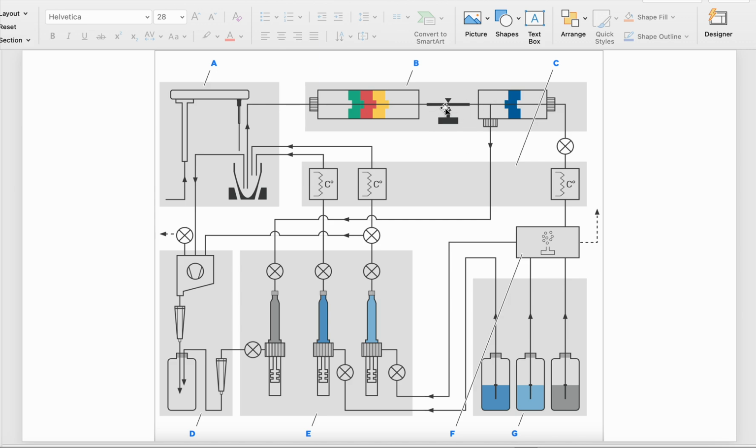This one from here is fed to here, and this one from here, and then the voltage is fed to the computer, and the computer stores it in memory. Then it is vacuumed and cleaned, everything. Then the sample comes here, and then diluent, like 450, and 15 of sample are mixed here.